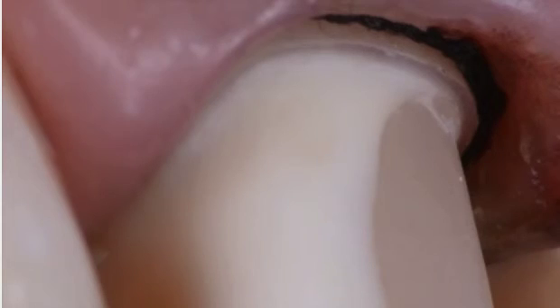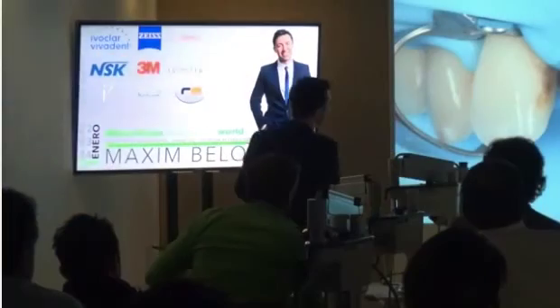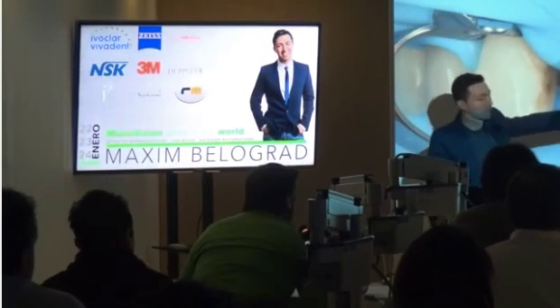This is the view to the margin. A real mixed fight case, as I call this stuff, like an endo-restorative full range from endodontic to restoration, from the planning to realization of the treatment planning. This is the second appointment during which I was going to provide the treatment for lateral incisors.